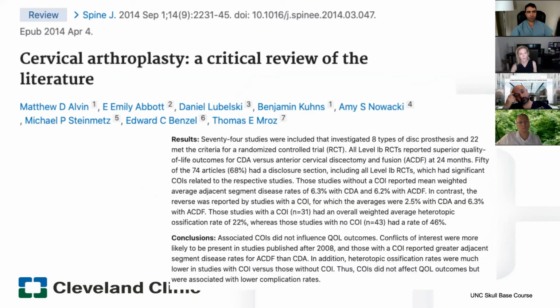Now, this is one of my favorite reviews for arthroplasty, and I suggest that if you have time, you look over this. The conclusions of these authors were just phenomenal, and I'll literally read this verbatim. This was done at Cleveland Clinic. They looked at essentially all the things that arthroplasties purport as being better than ACDF: adjacent segment disease, motion preservation, faster return to work. And they looked at the author list and at authors who had a potential conflict of interest.